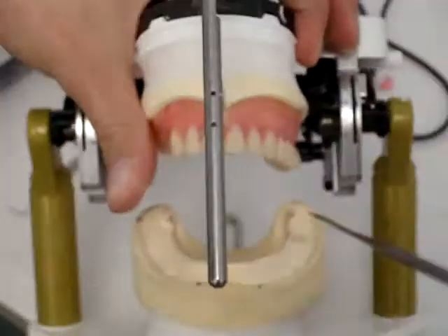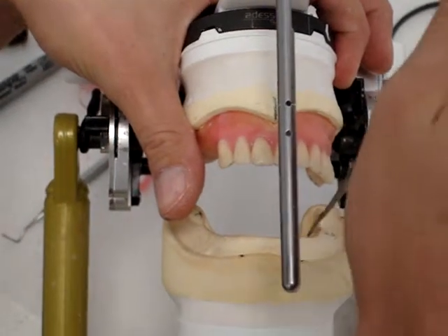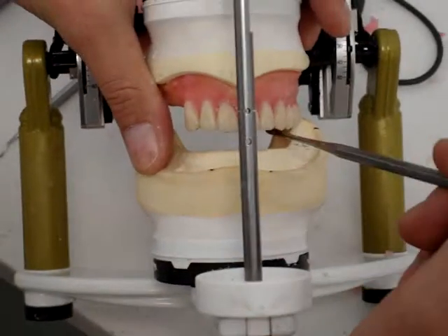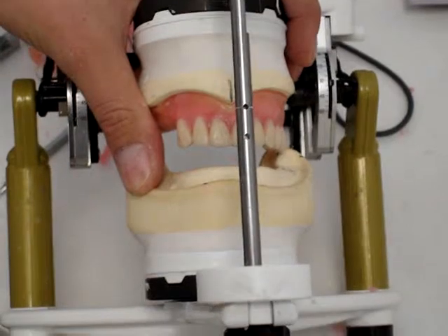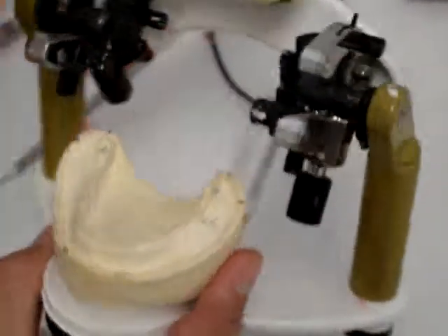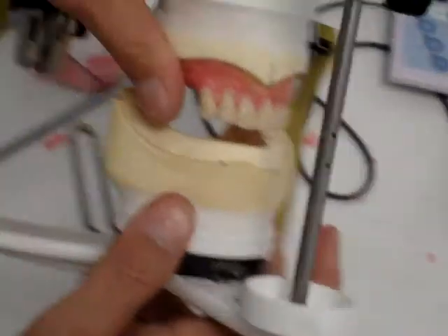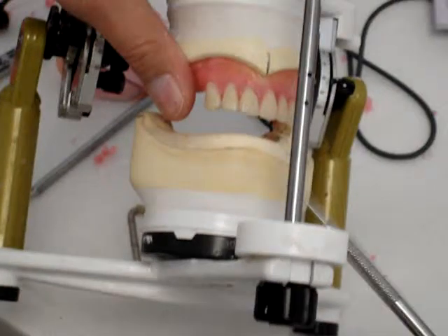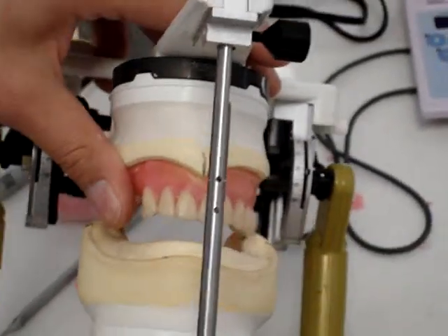Now for this particular ridge, because it's curved, it's not going to be exactly right on the way we drew our line. It's just slightly lingual, but especially for this side, you want to make sure that these teeth are right on ridge. That's one of the things they check for when they're grading. They'll take the mandibular teeth off and look and see how on ridge this person is by looking at these cusps in relation to this ridge.